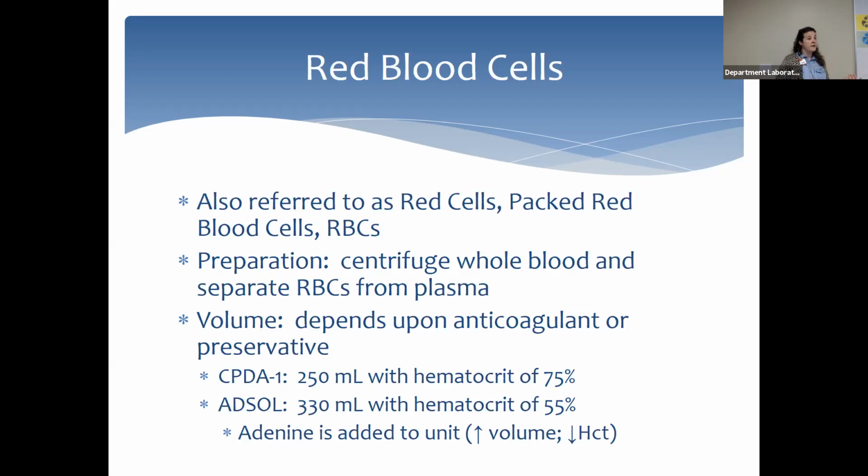However, there are some studies, if you research this, that say addition of Adsol not only prolongs the shelf life, but also makes the process of transfusing these red cells easier. Those red cells are less concentrated, more liquidy, and when you add the saline during the transfusion process, it makes entering the patient a lot simpler. You can research that. There are articles out there about that.